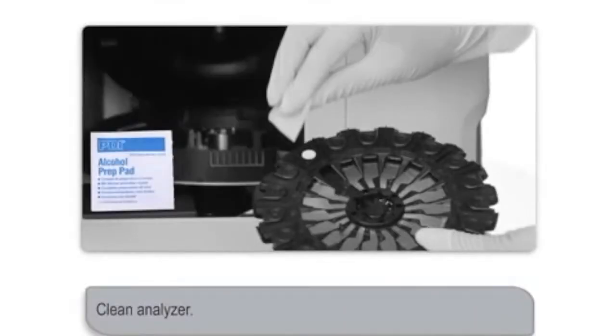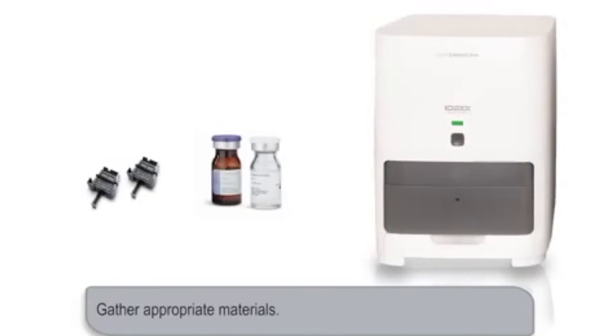Before you begin the quality control process, you'll want to ensure that you have cleaned the internal components of the analyzer using the on-screen instructions and that you've gathered the appropriate materials.